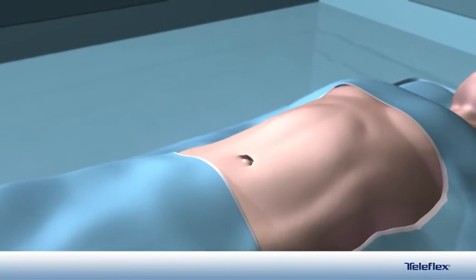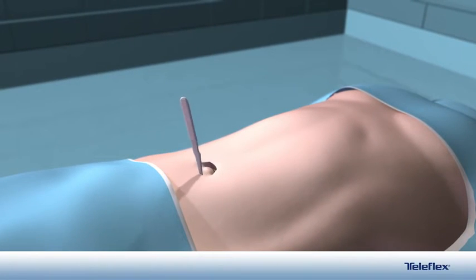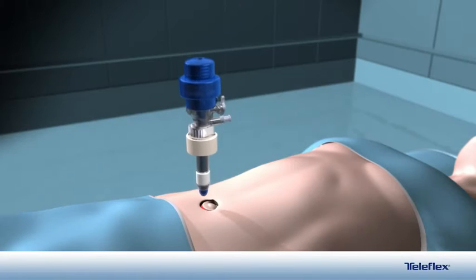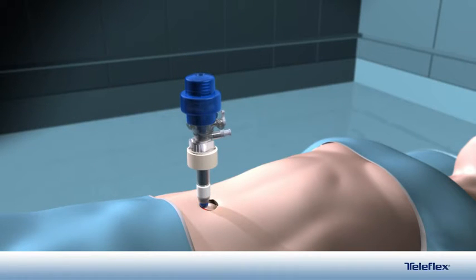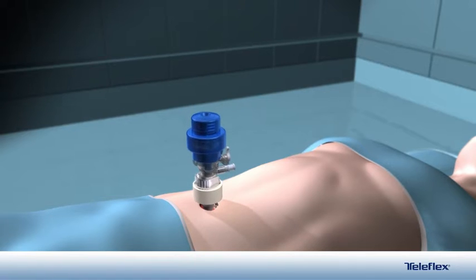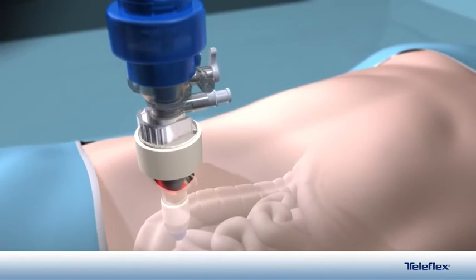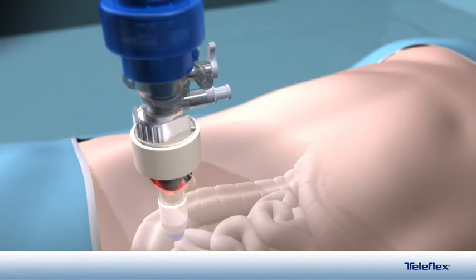The patient has been prepped and the surgeon is now ready to insert the balloon open access port. A 10 mm balloon open access port is inserted in the umbilicus using the Hassan technique. Note the balloon portion of the port is inside the peritoneum.